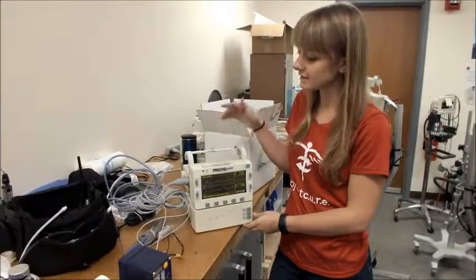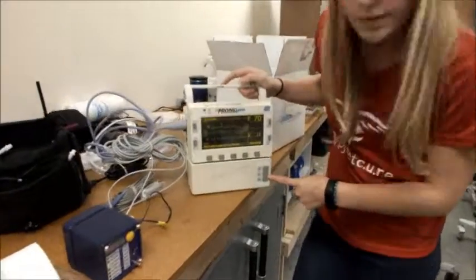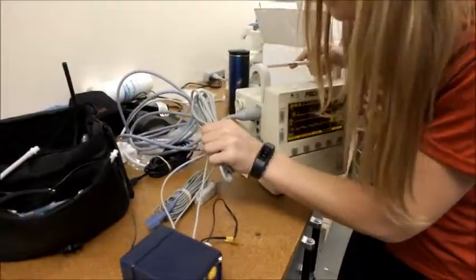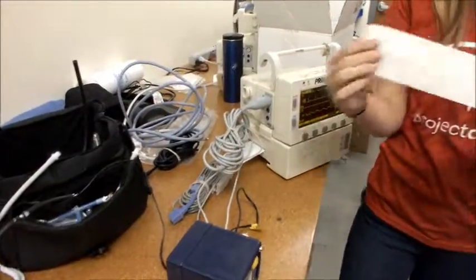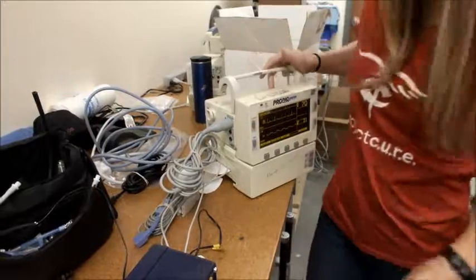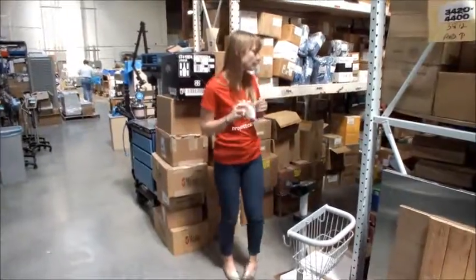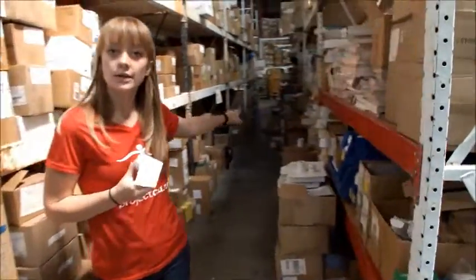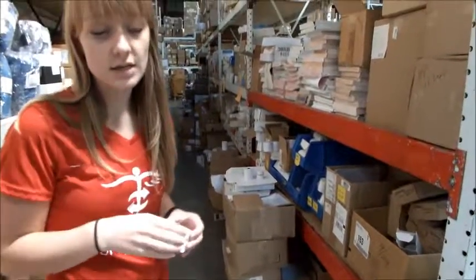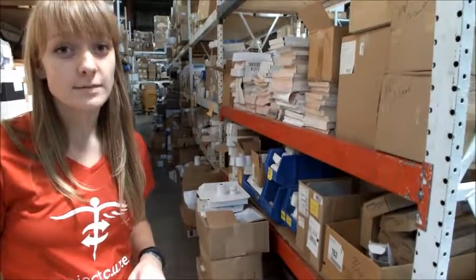The last thing we need to do to test the EKG machines is to double check that they can print. Press either print trends or snapshot and out of the side of the machine you should see a piece of paper that returns a graph. If it doesn't work, you might not have the right paper. If the machine says out of paper, look for the correct roll in the shelf back here — make sure the width of the roll is the right size for the machine. If you have any questions with this part, you're always welcome to ask somebody for help.